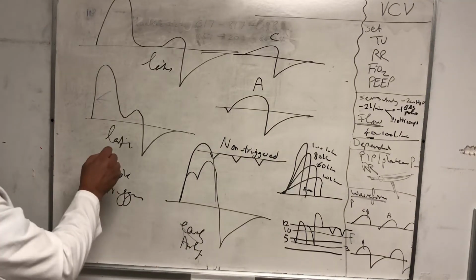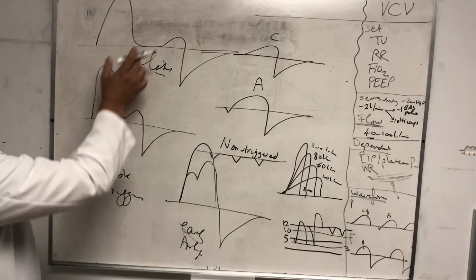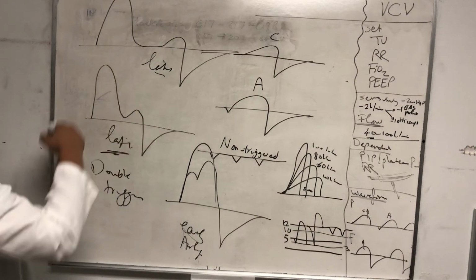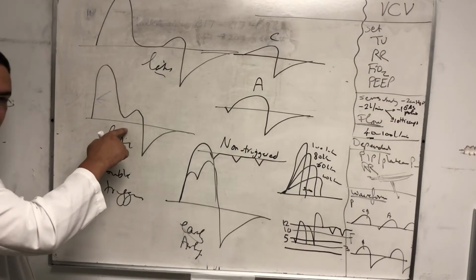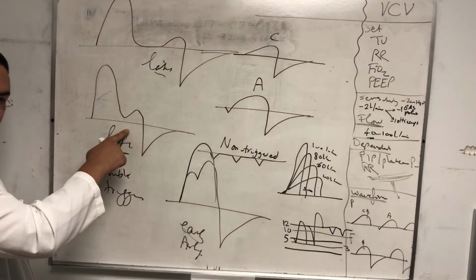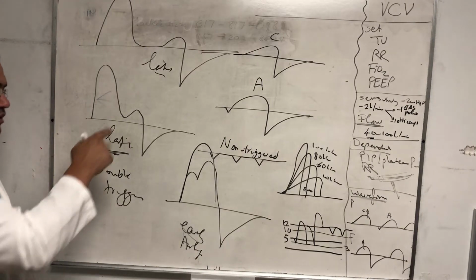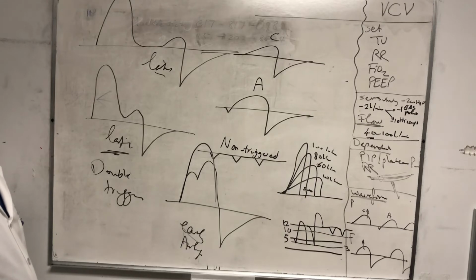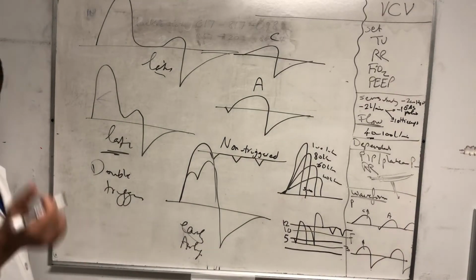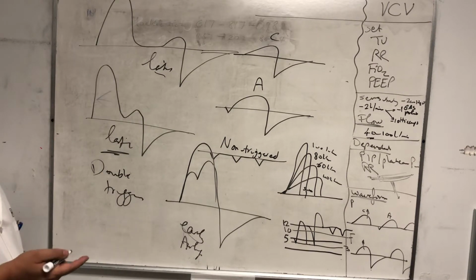Right? The late double triggering, these two are the same. But this one, the breath is a little bit shorter. This doesn't happen a lot in volume control, it happens mainly in pressure control, and that means the I time is too long, and the patient is too awake for it. You're holding the patient in inspiration against his will, so he wants to take another breath, and you're not allowing him, so he's forcing his way into the second breath, but because of the valves and struggling with the pressure, he pulls out a smaller breath like this, and he becomes very uncomfortable, right?